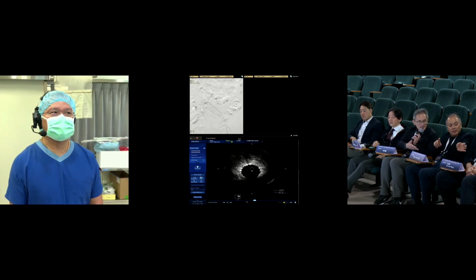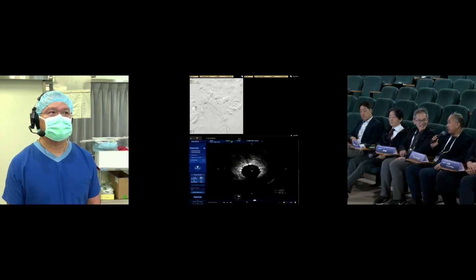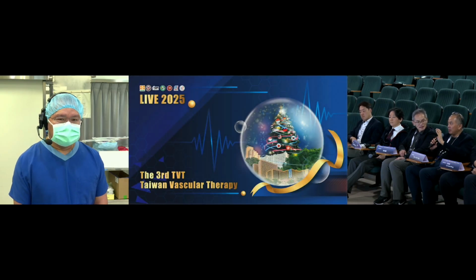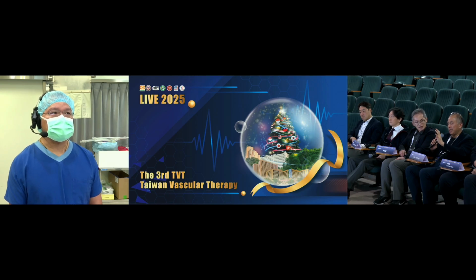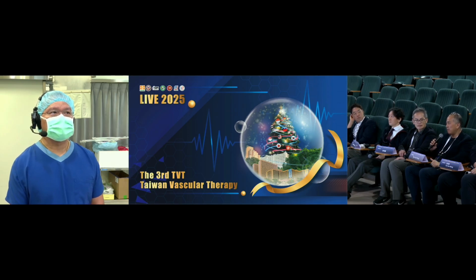And Professor Tan? Yes, being a surgeon as well, I'd rather do an open repair, the traditional open repair, which is an art being lost. But for the correct anatomy, and for the smaller popliteal aneurysms, I think there's a good role for endovascular, especially if there's no discrepancy of the landing zones from proximal to distal. When you get the discrepancy, that's where you get your endo leaks and your reintervention rates are much higher. Especially for older patients, probably more than 80, who are never such fit patients, those are the ones to go for endo. For the younger ones, a person who can do a good open repair, I still say open repair is the way forward.